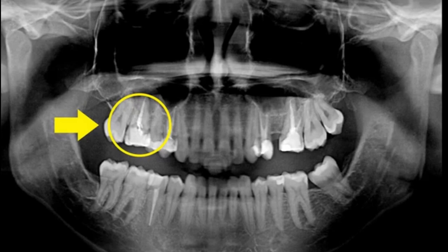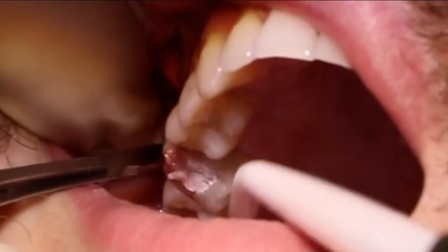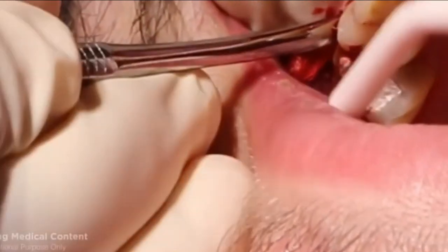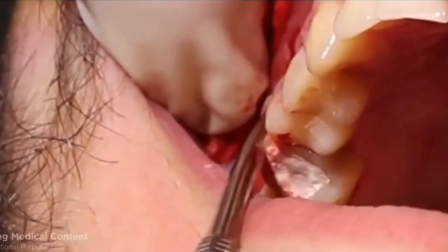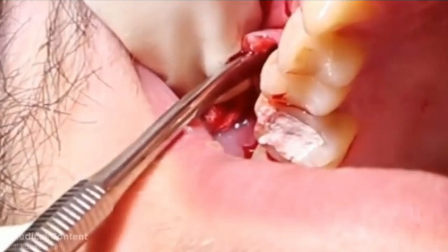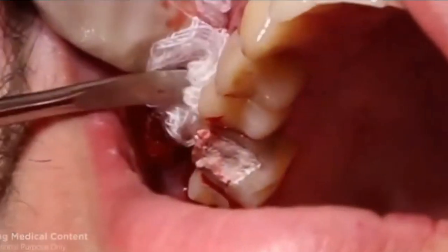After that we place a collagen membrane on top and suture everything together. Here I'm using a number 15 BP blade giving a circular incision around the molar tooth, and using a periosteal elevator I'll be raising a mucoperiosteal flap around the second molar tooth. It is very important that when we are using this periosteal elevator we have to be very careful that we do not tear the flap, otherwise the blood supply to this area and to this implant will be totally compromised. That's why we try to avoid giving any vertical release incisions or cuts on the gingiva.